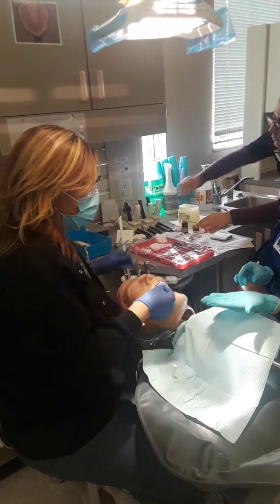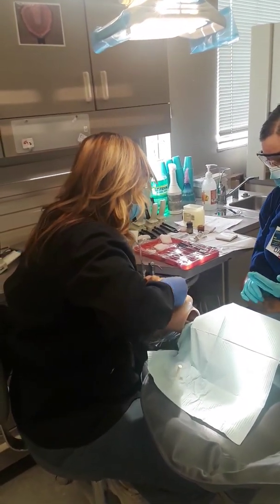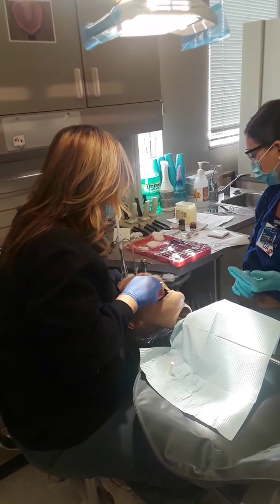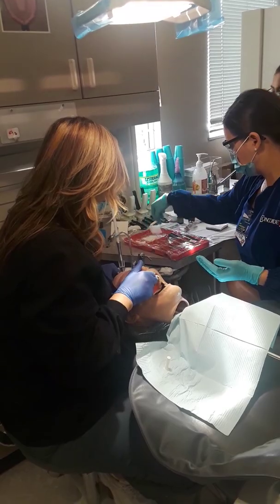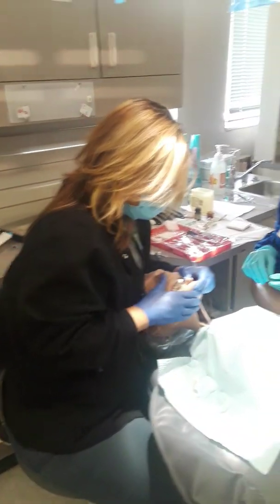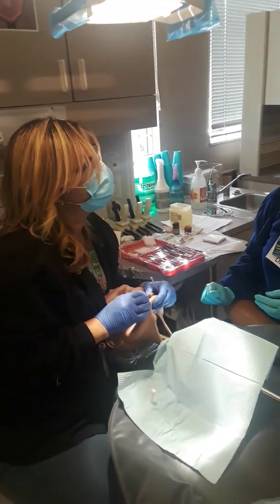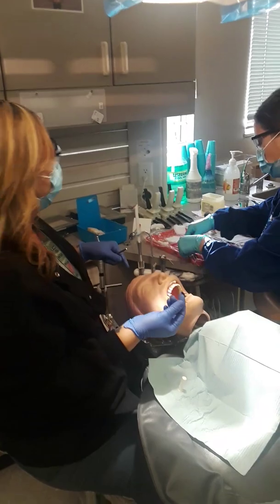All right. First, I'm going to push really hard because I need it to fit that shoulder. I want to make sure it's on good. Then you're going to pass me a cotton roll to bite on, because we're going to wait for the cement to get hard. So patient's going to be biting. Okay, time lapse, 3 minutes past. Cement's hard.